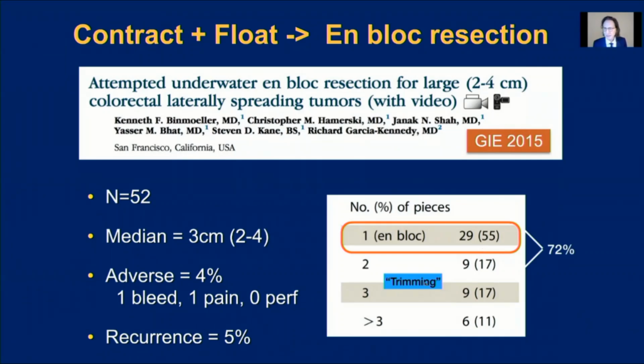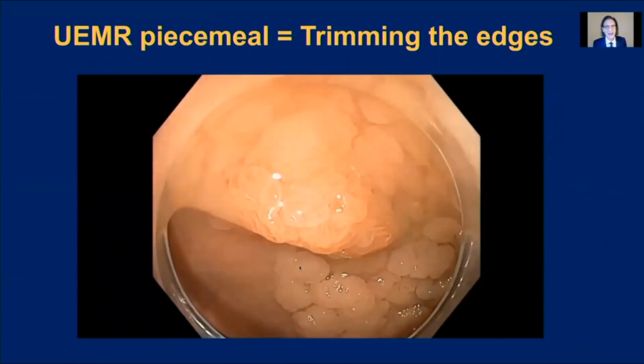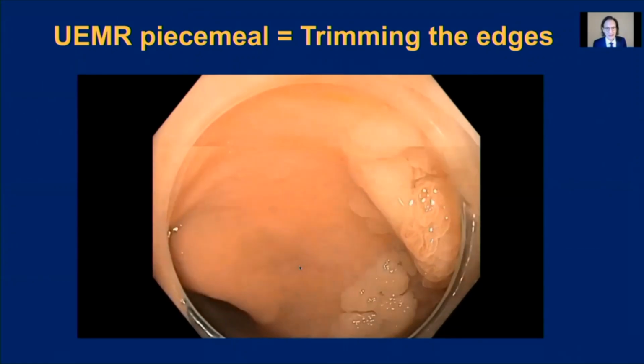But I want to emphasize that the additional resections are not strictly piecemeal the way it's performed with conventional EMR. I consider this more of a trimming because we attempt en bloc, but there may be some residual at the edges, and the edges then are resected with a trimming strategy. So this video illustrates how this trimming of the edges is performed.